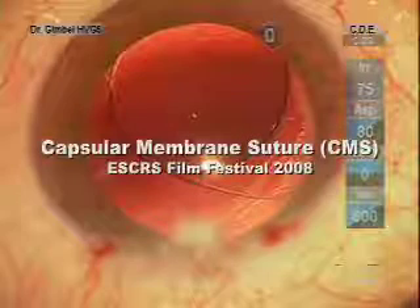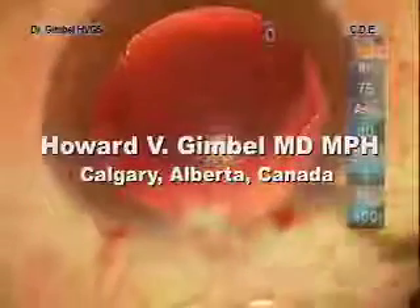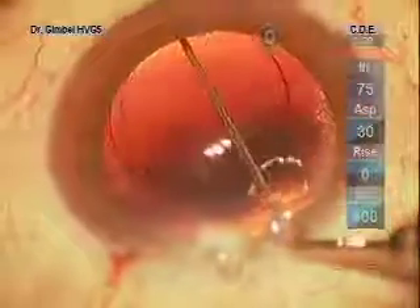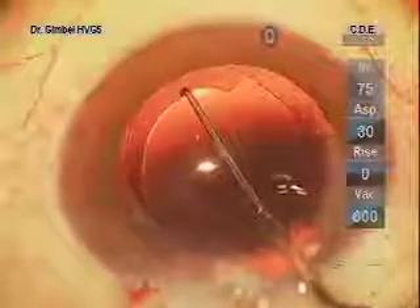I would like to demonstrate a technique that I have named capsular membrane suture for fixating sulcus-placed intraocular lenses when there's capsular membrane present, but the technique of membrane optic capture cannot be used — as in this case because the opening in the membrane is too large for capture.